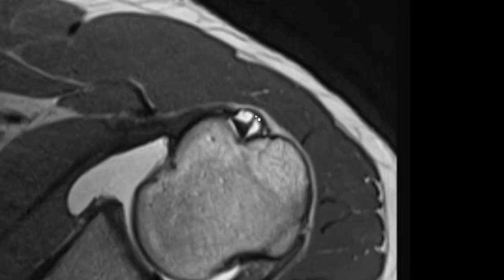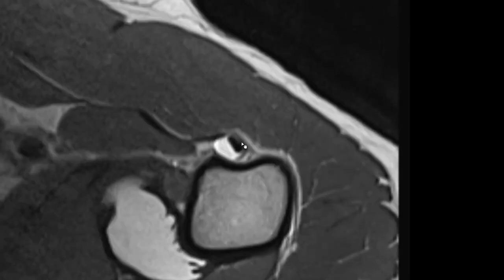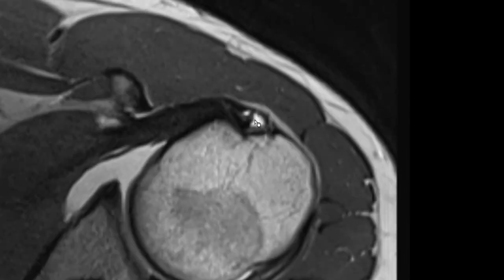Another structure here is this suspension of the long head of the biceps tendon. It's something you can frequently see, especially if there is fluid or contrast after arthrography within the bicipital groove. It's a normal finding.